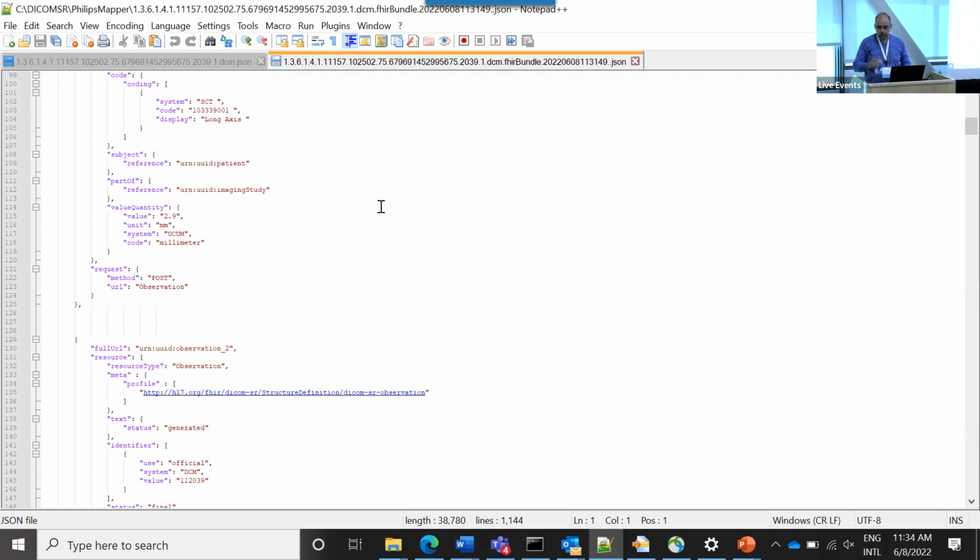We just pointed to generic observations because there were no existing profiles and we didn't want to create something as Structured Documents when you guys should be doing it. So if you hadn't looked at it before, maybe suggest that you contact some of the folks at Structured Documents and file a JIRA tracker so that next time we update it for FHIR R5, we can include this work in there. Because then you have the full textual representation as a composition resource that would point to all these details down below, which I think would be a great way to actually get people to implement it.